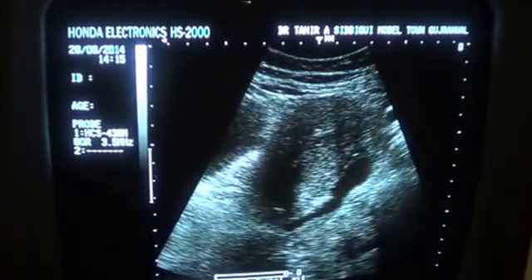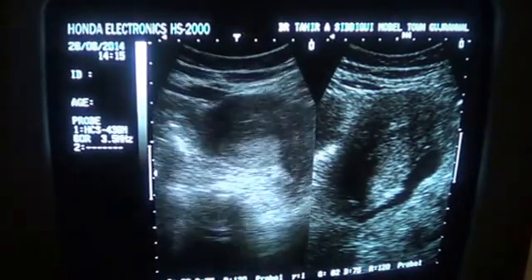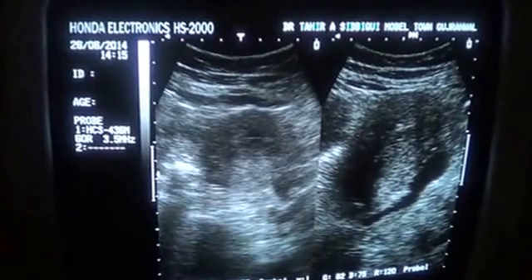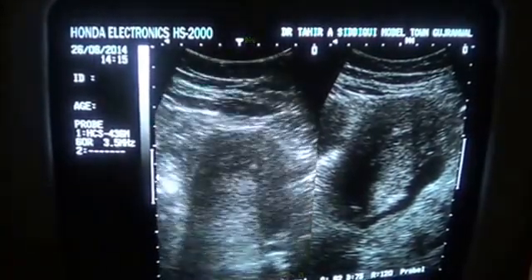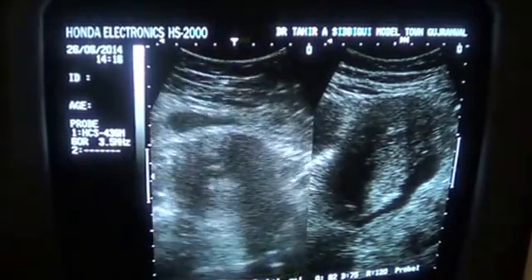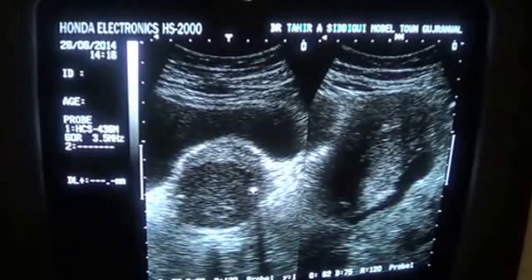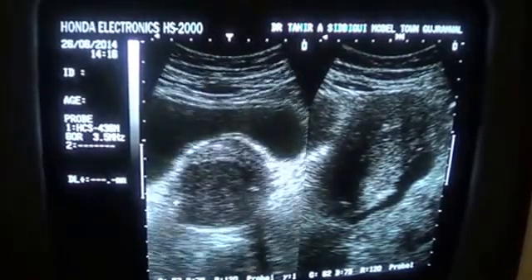We do see a small amount of fluid in the pelvic cavity. This is small amount of fluid in the pelvic cavity, and this is the transverse section, and this is the ovary, right ovary. This is the transverse section of the body of the uterus and the fundus of the uterus. You can see that the endometrial canal is in mid-cycle, and it is clear, central. And when I move the probe posteriorly, now you will see that there is the same consistency, and you can see small movement as well. You see, this is the calcification giving sharp posterior shadow, and small amount of fluid is also seen in this transverse section.